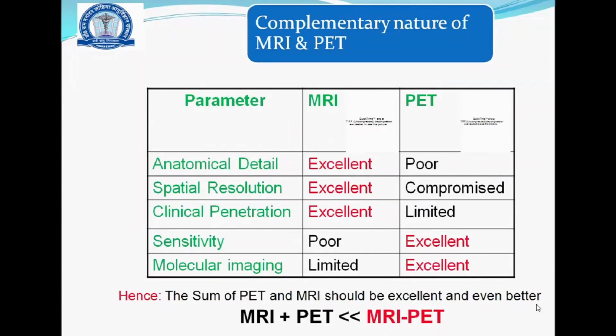Now, because of the radiation burden and the challenges with soft tissue, the soft tissue resolution in anatomical CT was very poor. Researchers realized: why should we not have an MR PET result? And what was the reason behind that?